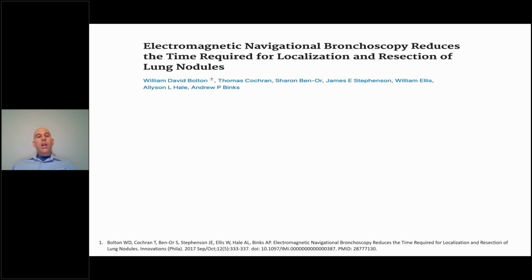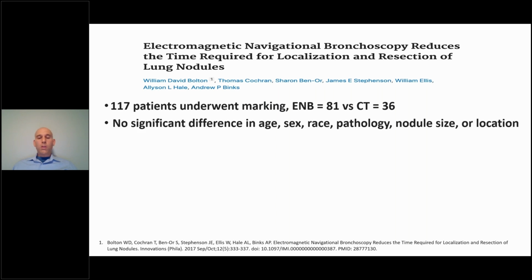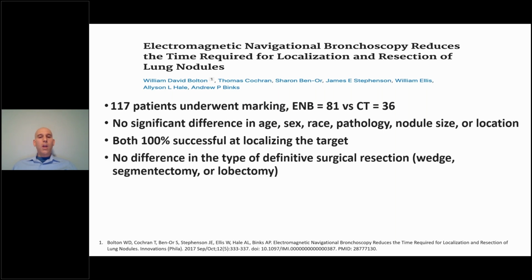Another interesting study that was done looking at nodule localization looked at time required for localization, and then not only the localization part, but then getting onto the resection. So this was a single center retrospective group analysis of 117 patients. 81 went navigation and 36 went for CT-guided localization. No differences in demographics or in nodule characteristics. And from a subjective standpoint, 100% successful in both in localizing the target.